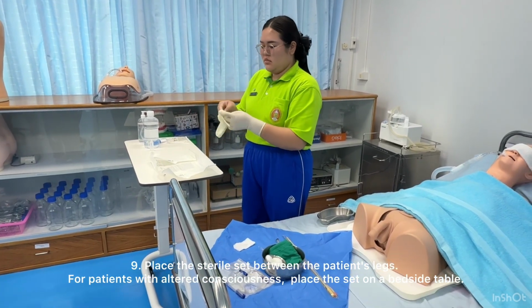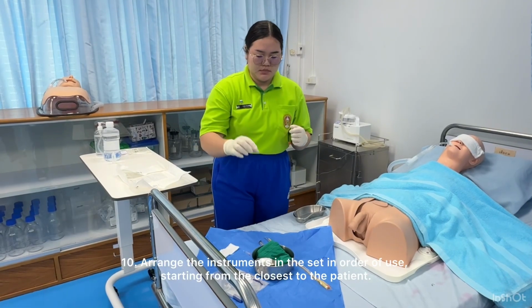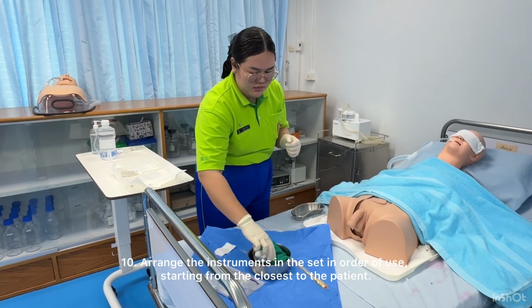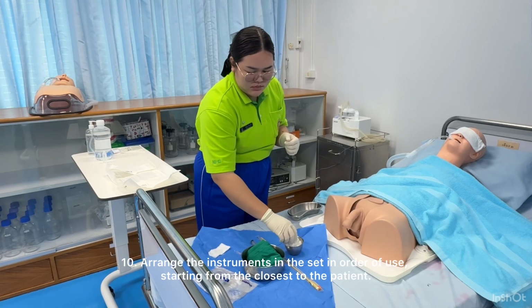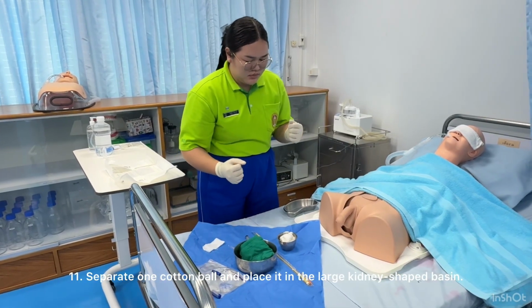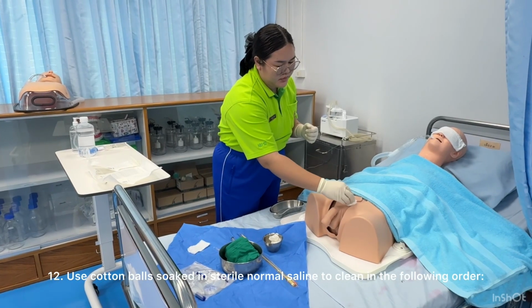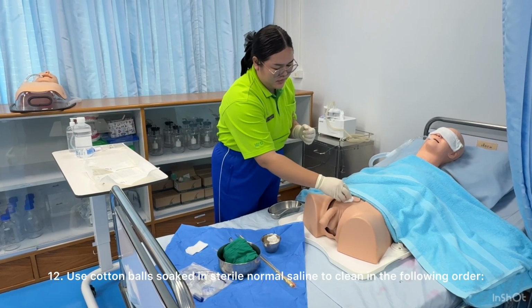For patients with altered consciousness, place the set on a bedside table. 10. Arrange the instruments in the set in order of use, starting from the closest to the patient. 11. Separate one cotton ball and place it in the large kidney-shaped basin. 12. Use cotton balls soaked in sterile normal saline to clean in the following order.